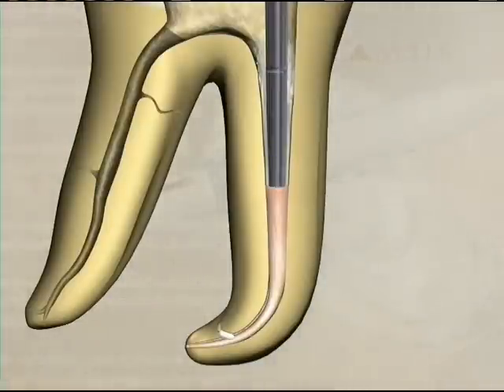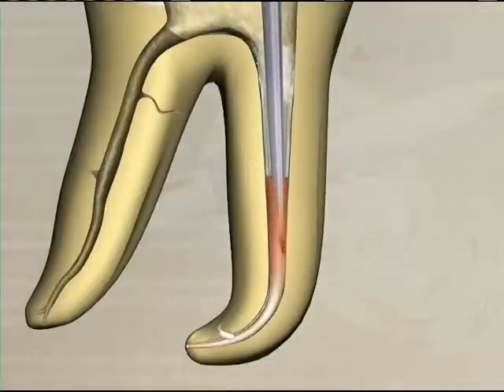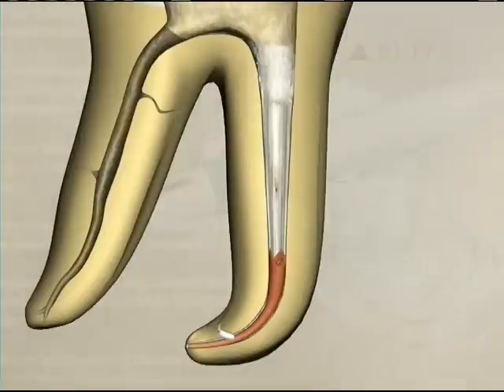This helps to minimize shrinkage. The heat carrier is again inserted and taken a few millimeters deeper into the gutta percha mass. As the power is turned off, the heat carrier is removed and another ball of thermosoftened gutta percha adheres to the instrument.